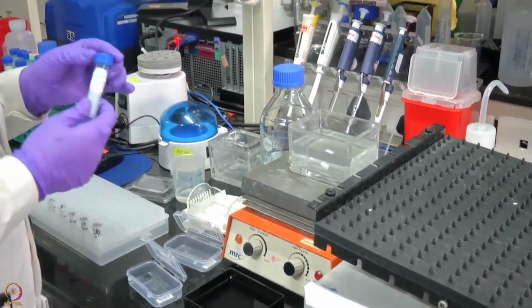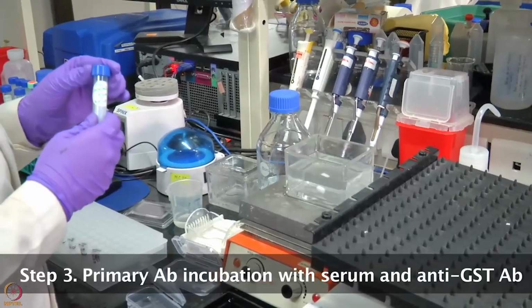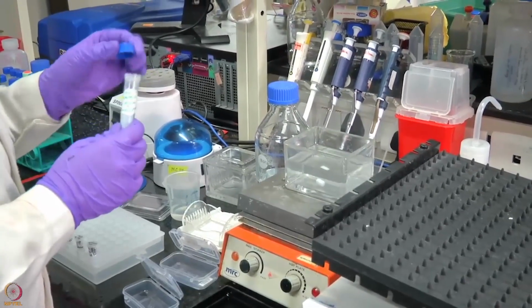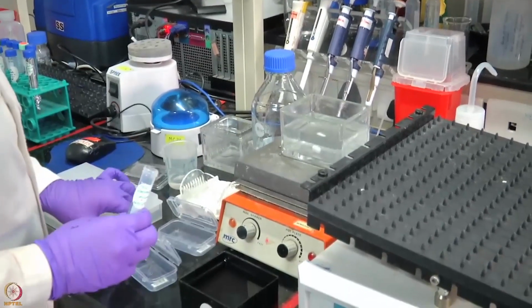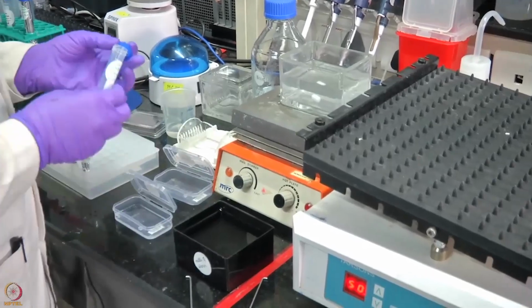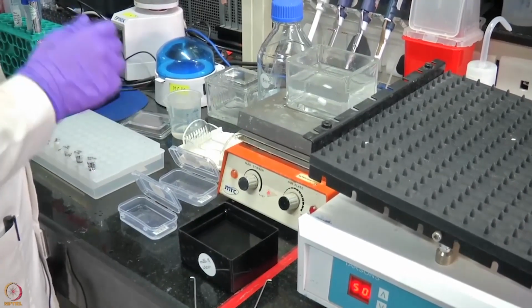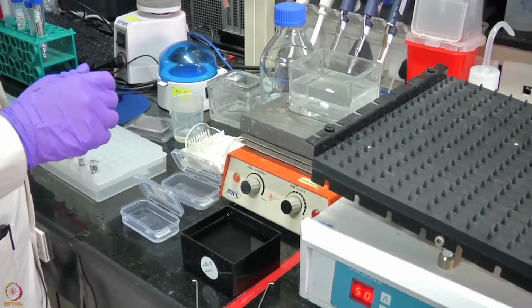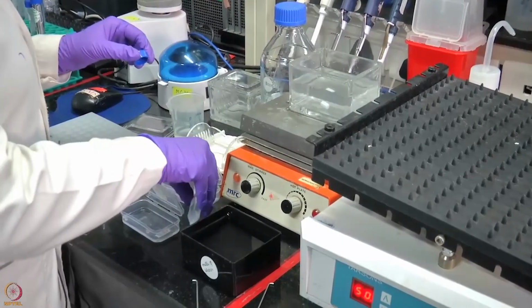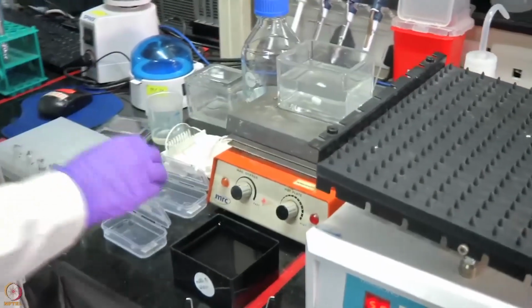And put the cocktail of primary antibody. So this cocktail contains serum and anti-GST antibody in BSA and TBST. So now this is done for two patients. So we will place the primary antibody in 2 different boxes. So for patient 2, we will place it onto the sample, onto the slide.